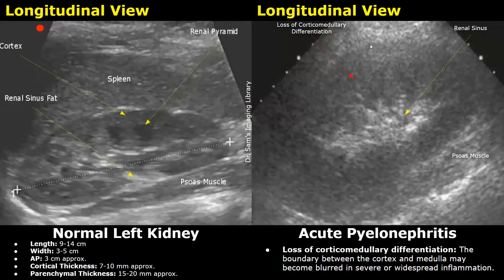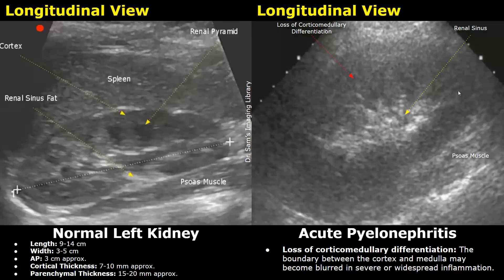On the right we have a case of acute pyelonephritis. In this case there is loss of corticomedullary differentiation — we cannot clearly differentiate between the outer cortex and the inner medulla. The boundary between the cortex and the medulla is blurred.